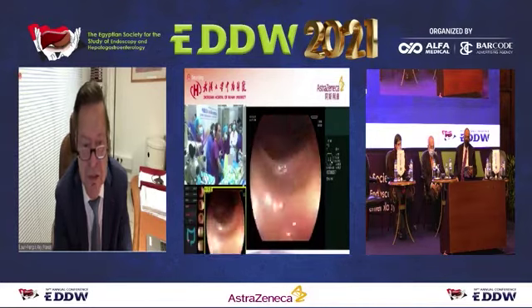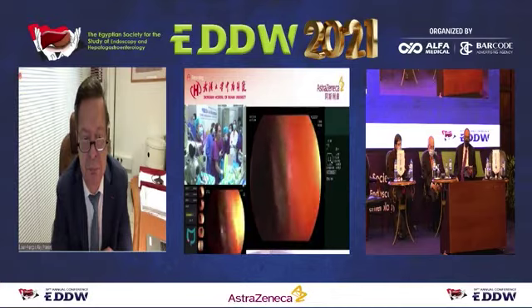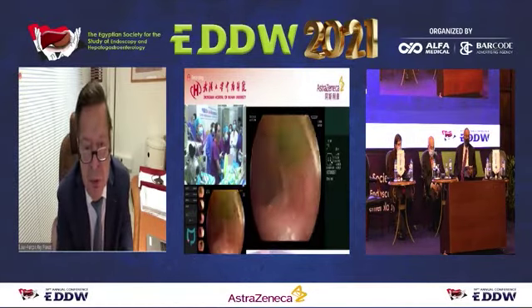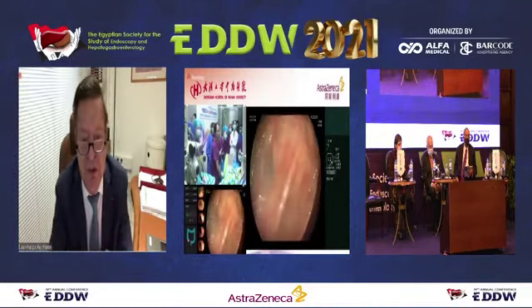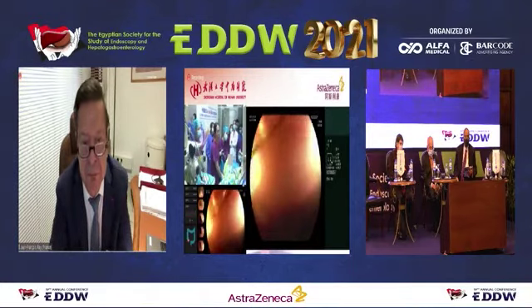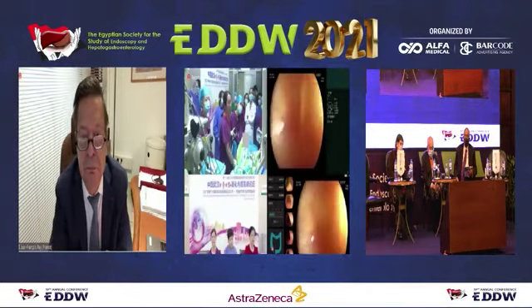I quite agree. But I saw a lot of green squares in your software. Is it a polyp or a false positive?